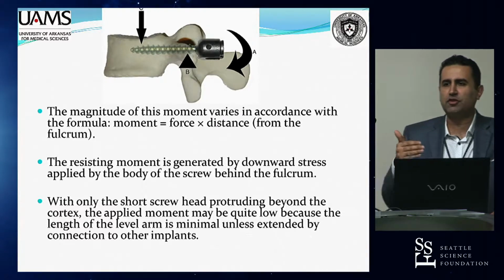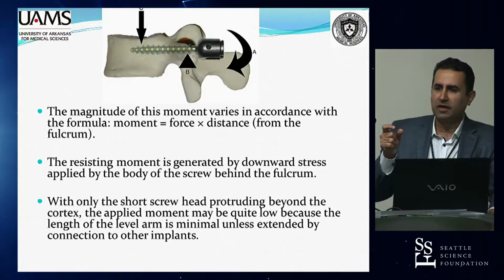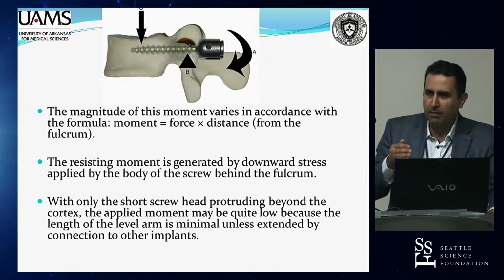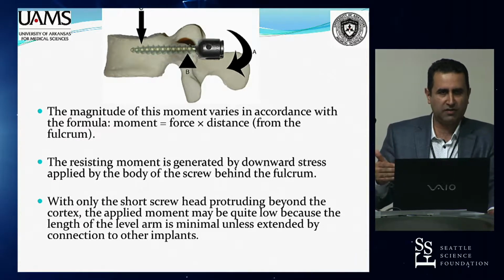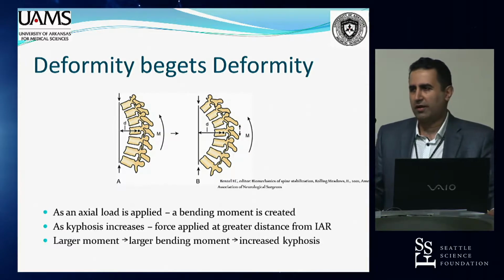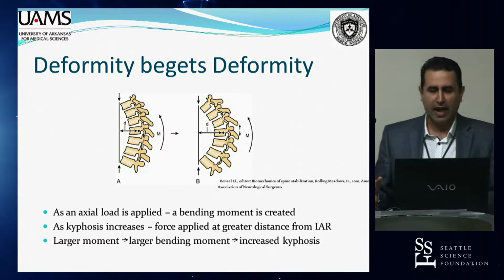And so when it comes to short screws, then there's only a short moment able to be applied by that cantilever. But when you hook it up to multiple different segments, there's great strength by increasing the resistance to the applied force and increasing the moment. Why do I talk about this? I talk about it because it has practical and clinical applications.